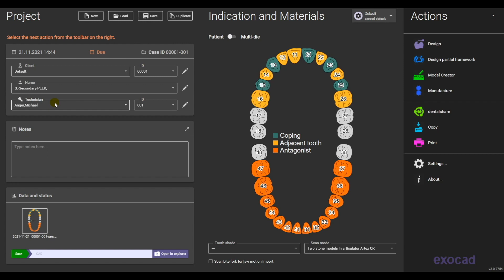Hello and welcome. My name is Michael Anger. In this video I want to show you how to make a secondary frame on primary telescopes which are already inside the mouth.